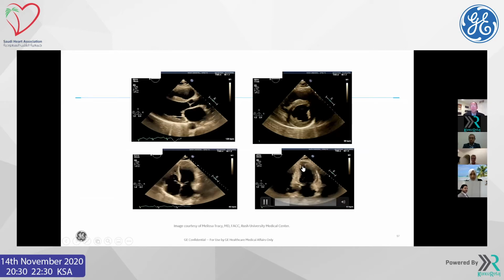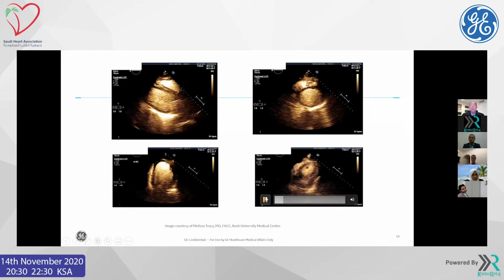I would probably use some other imaging technique, zoom, and try to increase that area to focus. And just to be sure, we will break out the contrast agent, just to be sure. In this picture, yes, in this one.